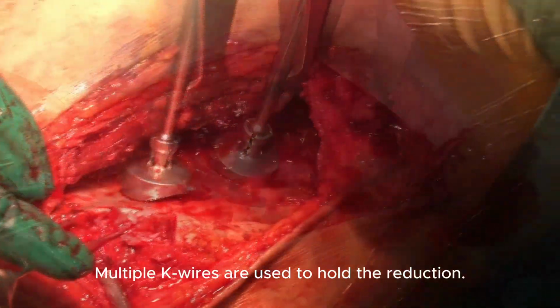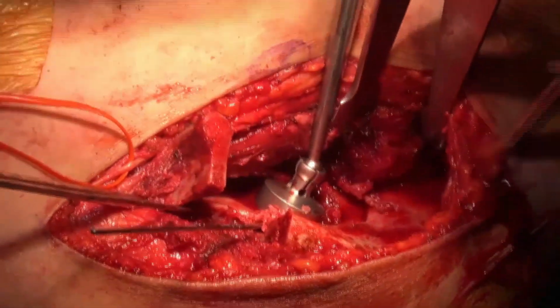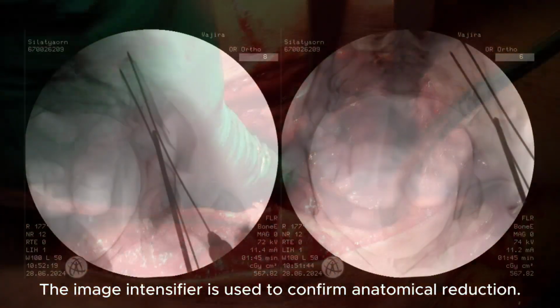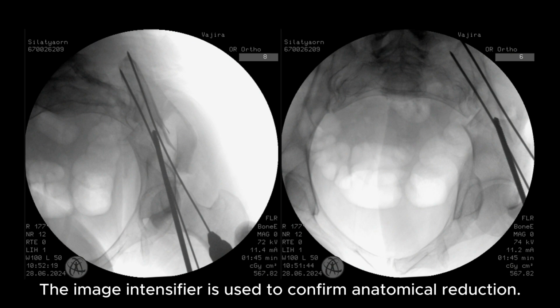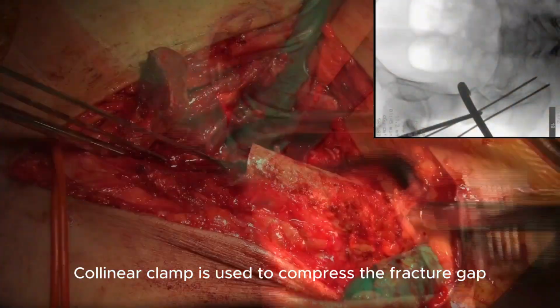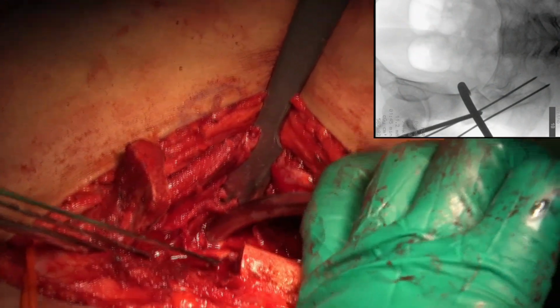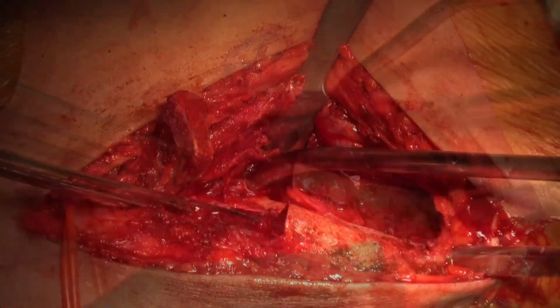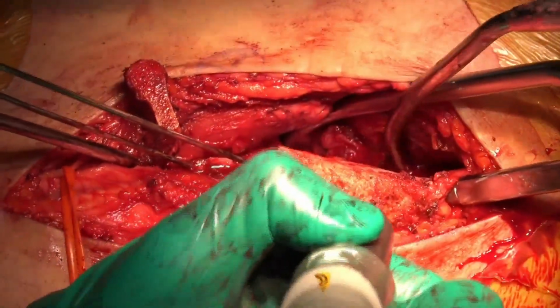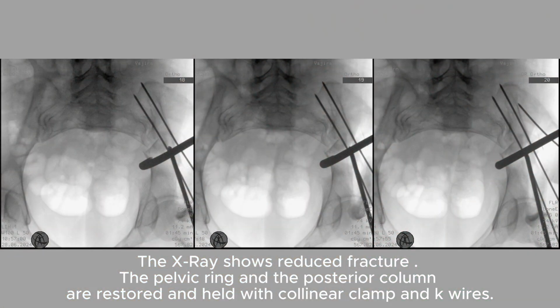Multiple K-wires are used to hold the reduction. The image intensifier is used to confirm anatomical reduction. Collinear clamp is used to compress the fracture gap. The X-ray shows reduced fracture. The pelvic ring and the posterior column are restored and held with collinear clamp and K-wires.